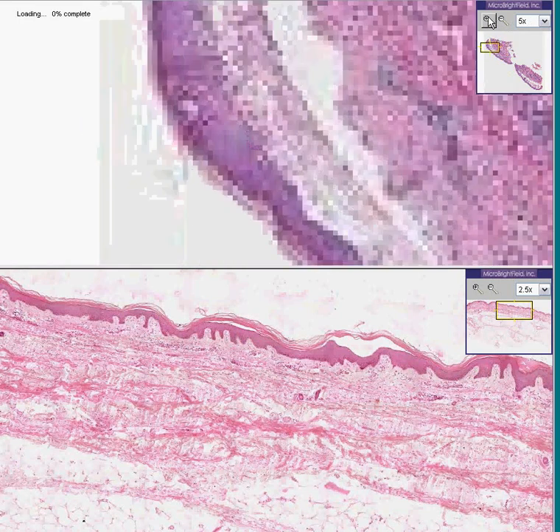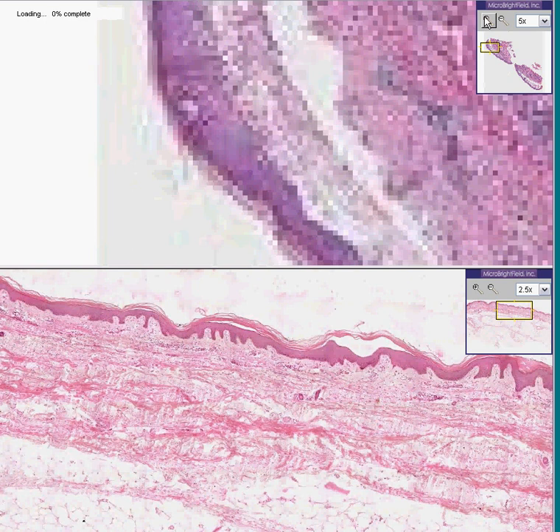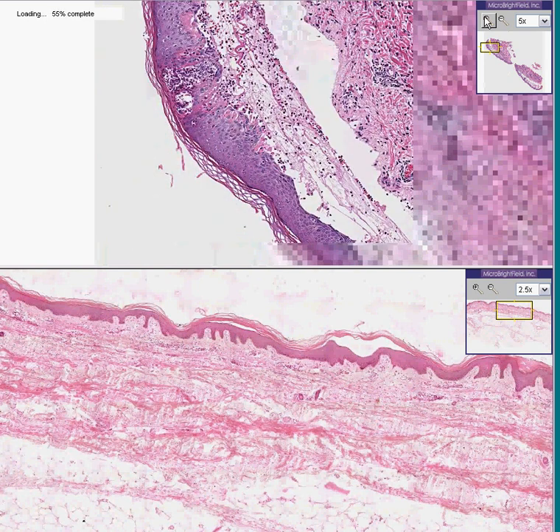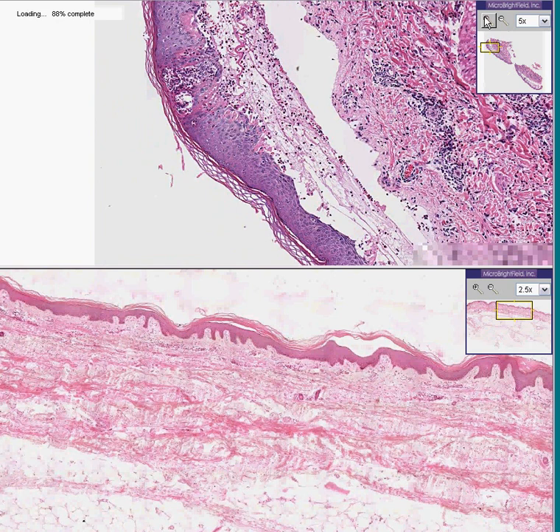This is herpes simplex. Herpes simplex is the single most common vesicular type of skin disease, and this is precisely what this vesicle looks like microscopically.